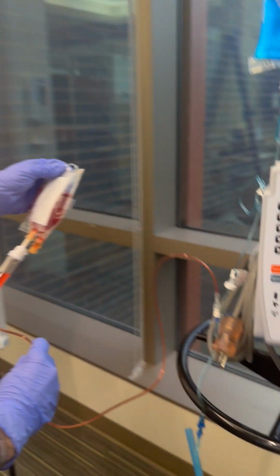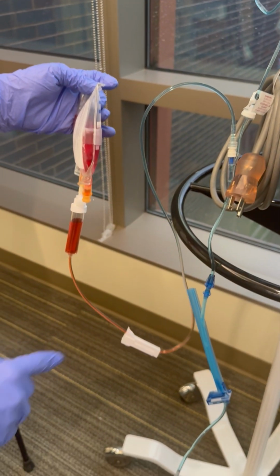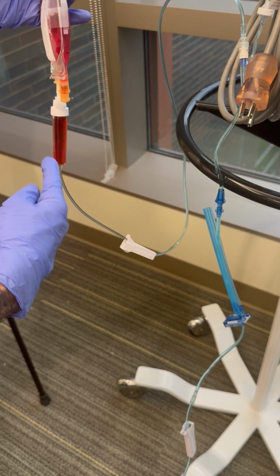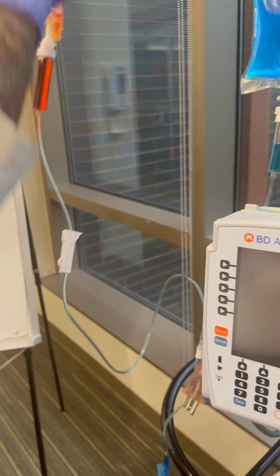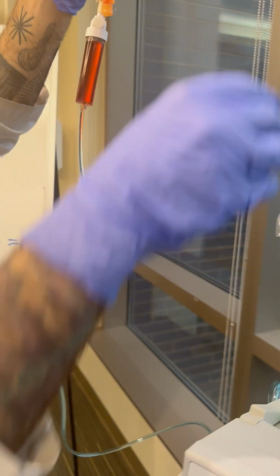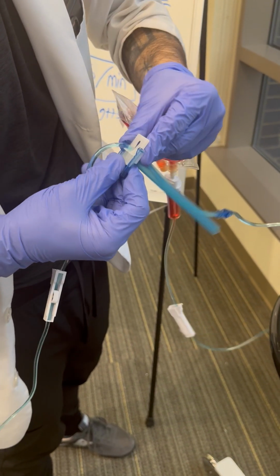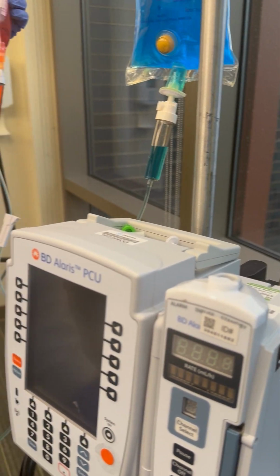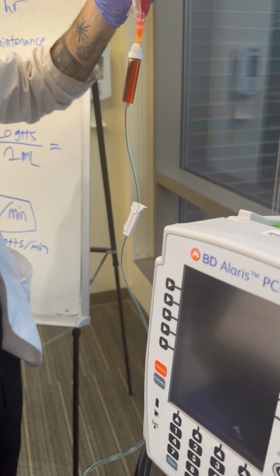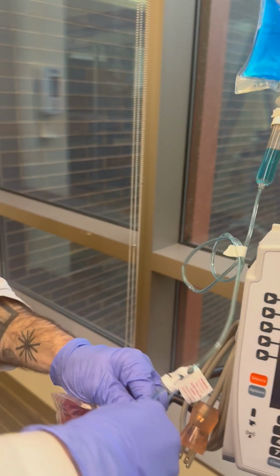So I can open this one up and actually just put this one down below this one. And you can see in the line, the blue is starting to push out the, yeah, you see, because now my drip chamber is completely full. Which you don't want to do because you can't actually see it dripping. So I can clamp here real quick. And let's see, actually, it won't go back the other way, will it? Yeah, it won't. So here's one thing I'll do, just to clear out that chamber.